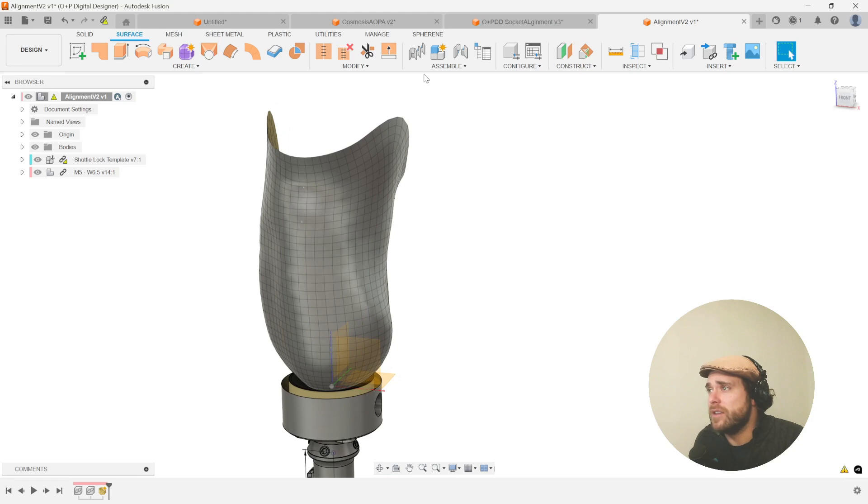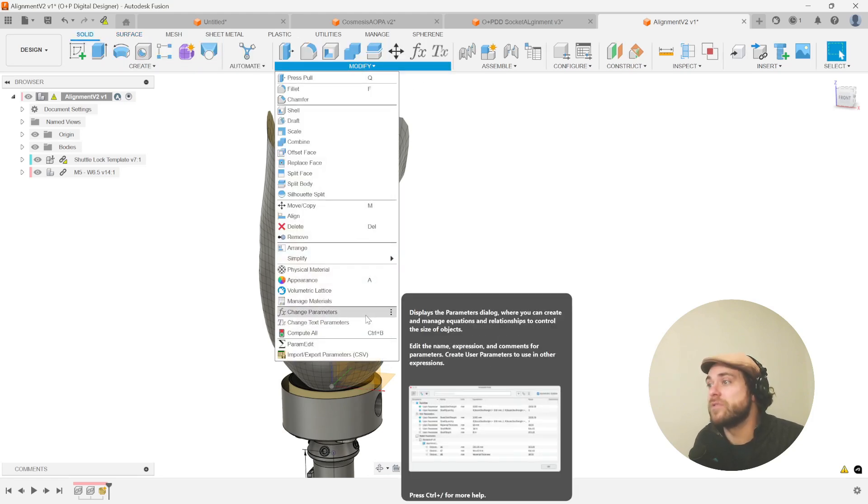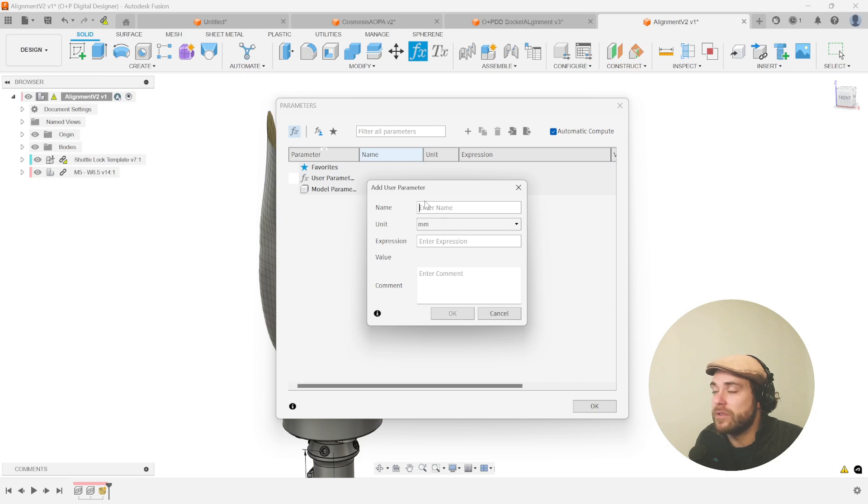A great way to set up an alignment is to start off by going to Modify > Parameters, where we can add user-based parameters. Something as simple as the coronal offset — that's a millimeter expression — we'll give it a value of five. It's great to have these not be zero when you set them up. Another user parameter would be the sagittal offset — you could also call this the AP offset or the ML offset.